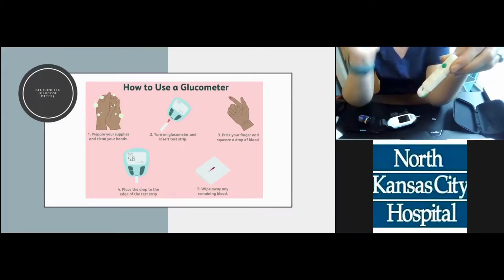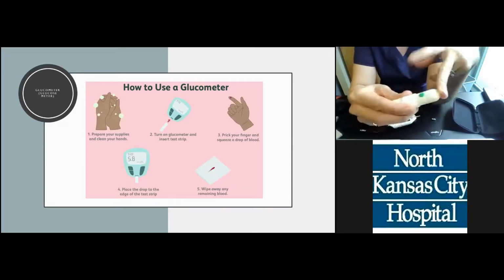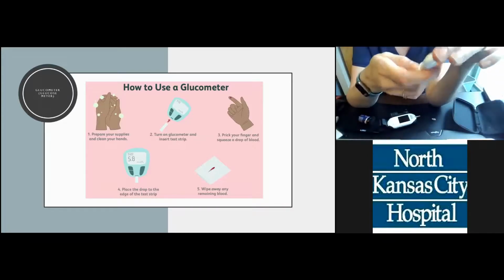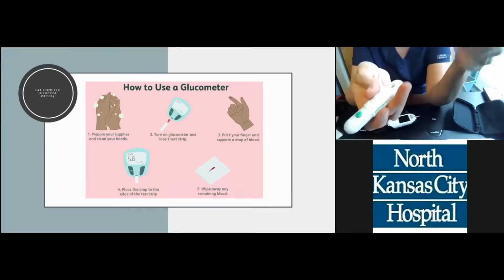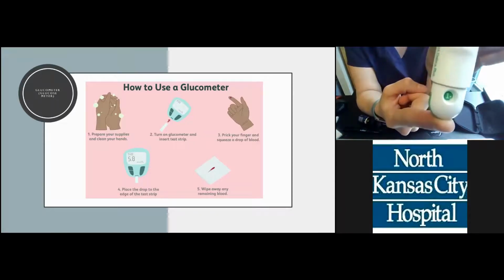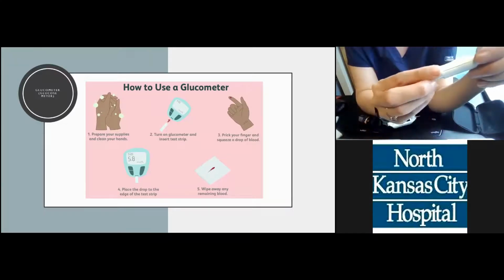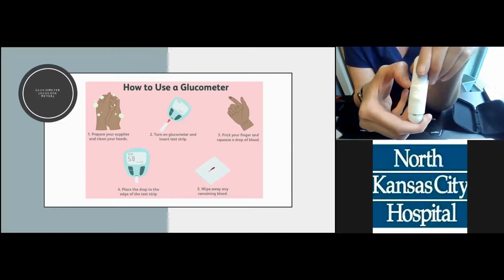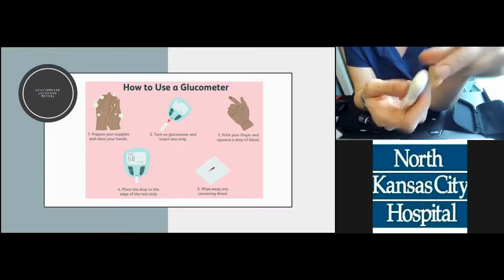This green button is what's going to stick my finger. So I'm going to press firmly on the side of my finger, not all the way on the side, but just off center, right there. And I'm going to push the green button. Now, I didn't feel anything, which means I don't have a deep enough level. So right here, you can see this little green box, and you see the 1. For me, I need to turn that up to a 3. Everybody's a little bit different, but I know what mine is. So I'm going to turn it up to 3, pull back again, put this on my finger, and push the green button.